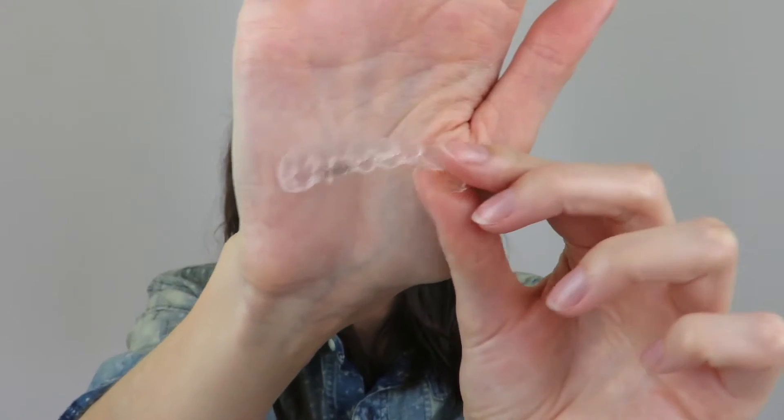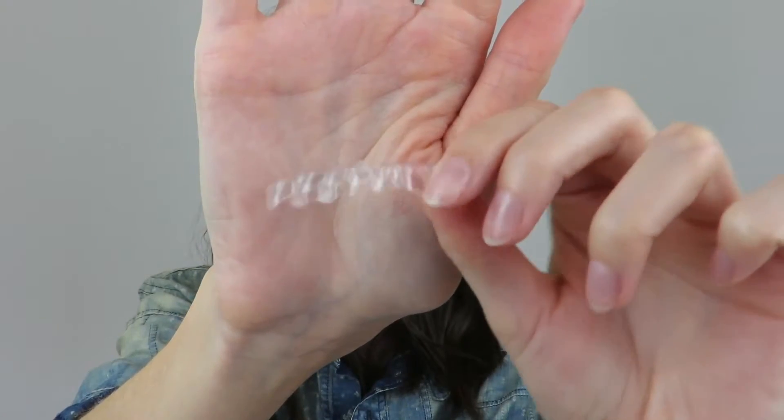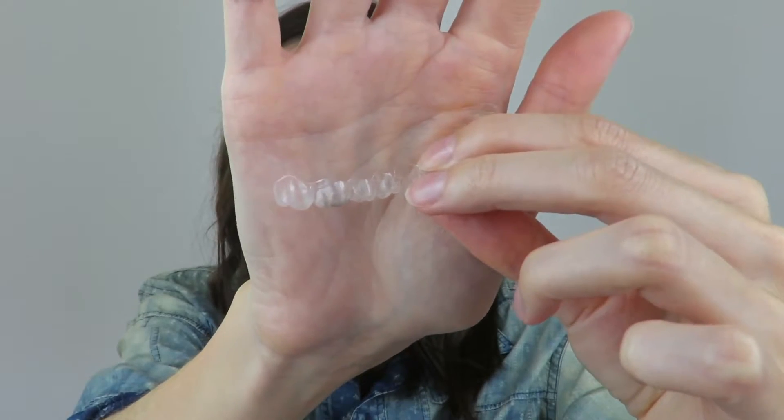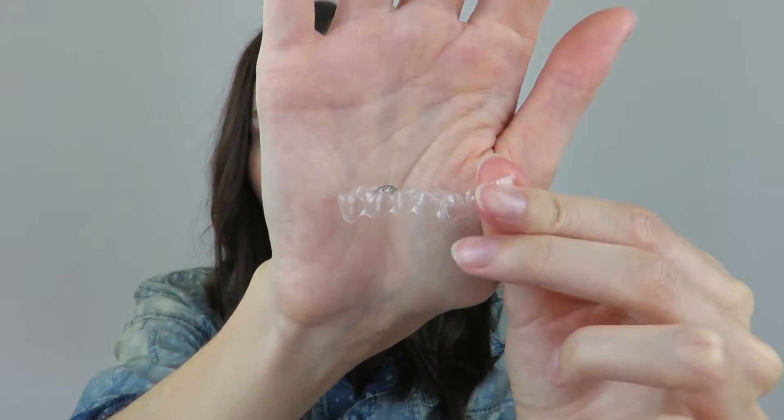I should probably quickly go over what Invisalign is because some people may have no idea. Invisalign is a sort of clear alternative to traditional braces. You don't have the metal and the wires on your teeth. Depending on where your teeth need to move to, you will have attachments that are bonded onto your teeth, and then you have these clear aligners. It's kind of like a thin clear plastic and it's not really noticeable on the teeth. The only part that's noticeable is where your attachments are if they do protrude out a little bit.